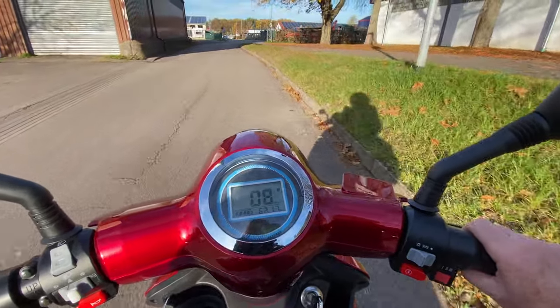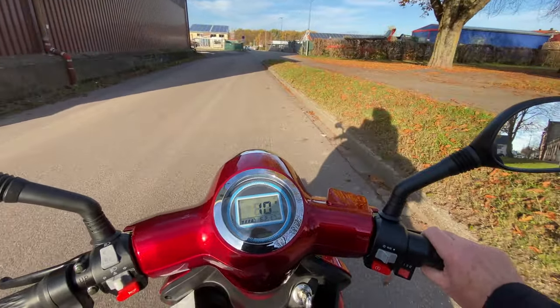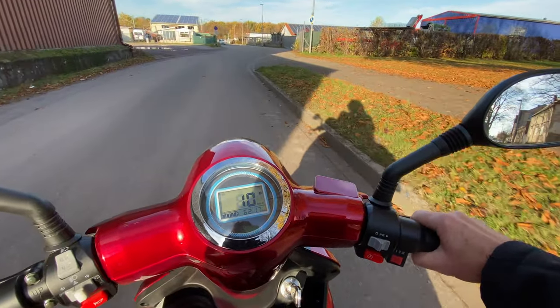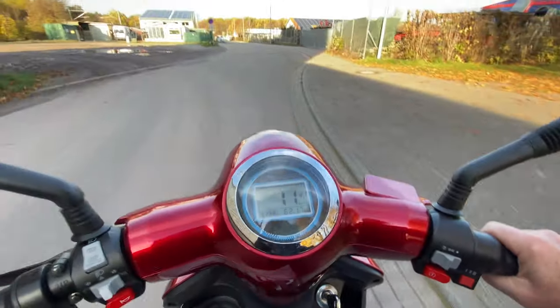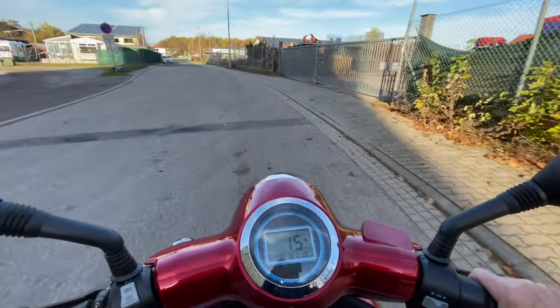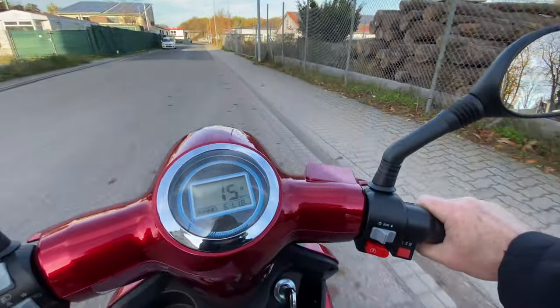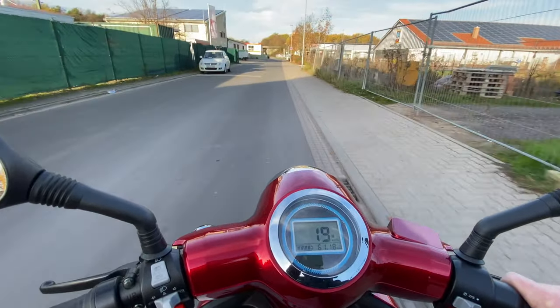First, level 1 with 10 kilometers per hour — I drove all stages at full throttle. Of course, you can also drive more slowly at every level by applying less gas. Then level 2 at 15 kilometers per hour. And now level 3 with 20 kilometers per hour.